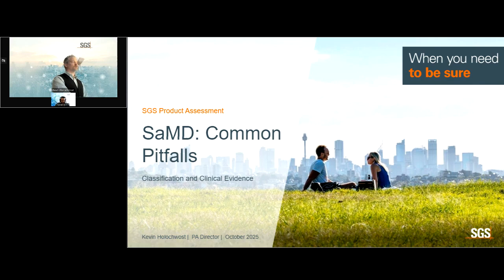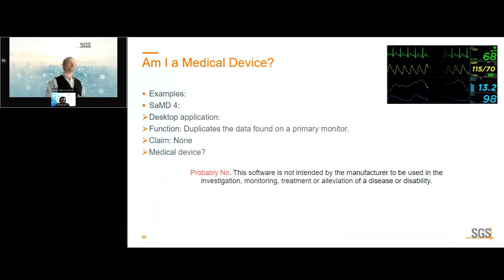So the answer is probably not. So I made no claim. If you look inside the MDCG 2021-24, which I've referenced a handful of times already, this is actually a specific example that's given inside that MDCG, which says that if it is duplication of data with no processing at all, the answer is it is not considered generally a medical device.